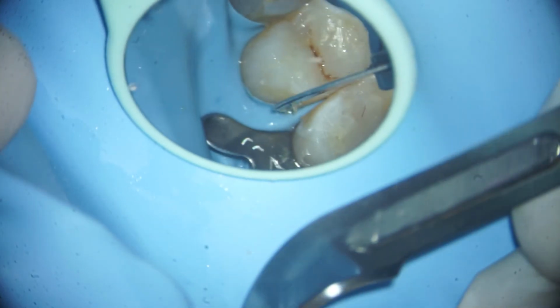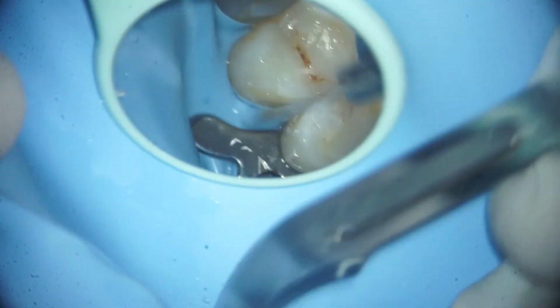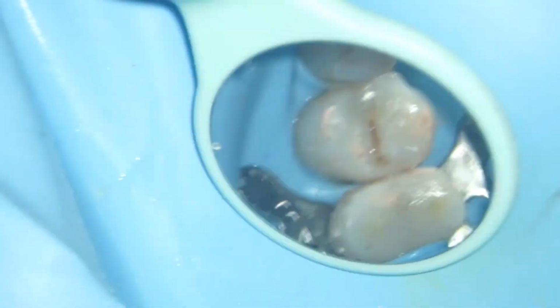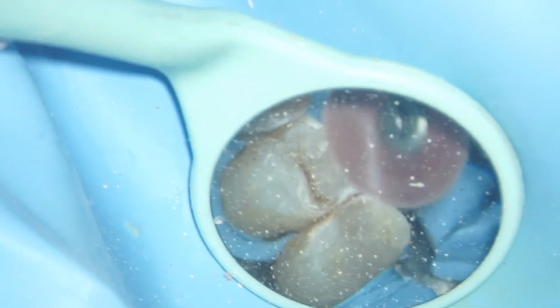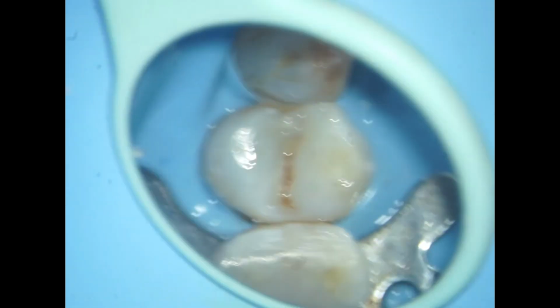We use a number 12 blade to clean off the flash or the excess composite in the gingival areas. A new blade is to be used every time, and this helps you in finishing your composites. The excess is being removed. Now I'll be using some finishing discs by 3M to finish the excess contours and to give the proper contours. After the discs, we'll be using some polishing buffs from 3M to complete our restoration. These are the polishing buffs we are using to give the final gloss to our restoration.